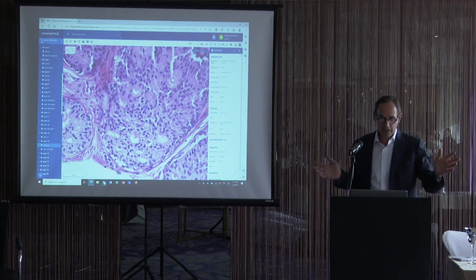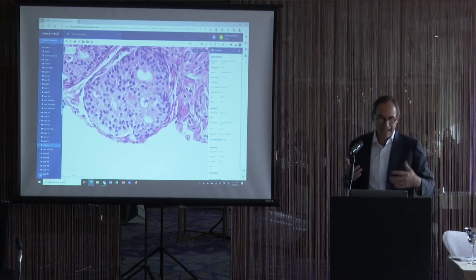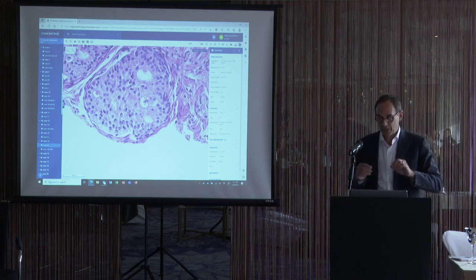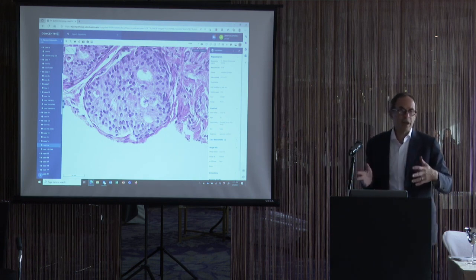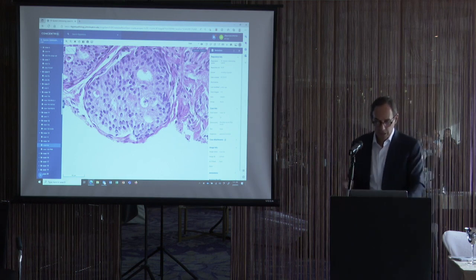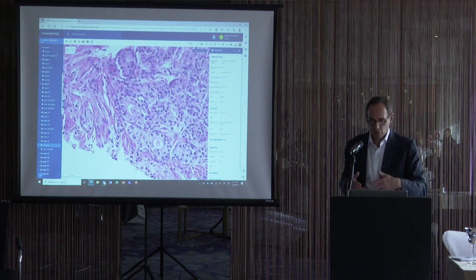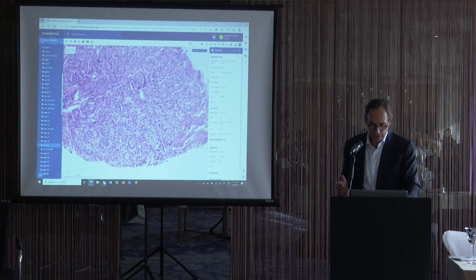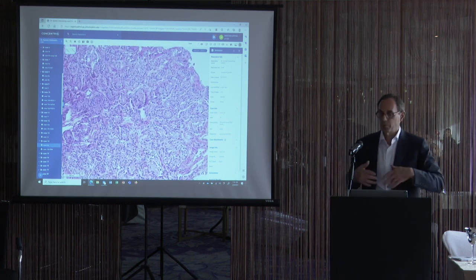But with all this cancer up and down this core, cribriform, small glands, the fact that we're not seeing any cytologic atypia is unusual. And you should ask yourself, despite being so florid, could this be a benign mimicker? Could this be florid adenosis and cribriform hyperplasia coexisting? And sometimes these various mimickers, adenosis, basal cell hyperplasia, cribriform hyperplasia, can all coexist in the same area of the prostate. So in a case like this, you, again, don't want to use your gestalt, oh, this looks like cancer.